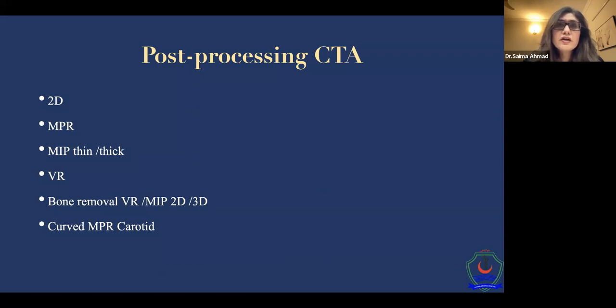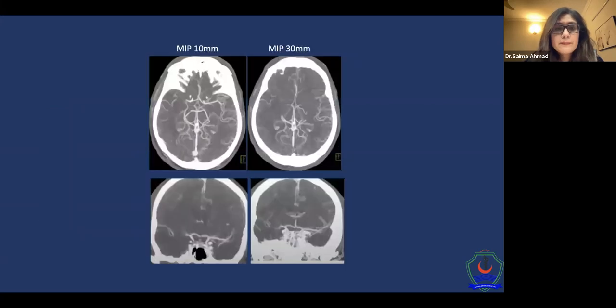Sometimes when you make the 3D reconstructions, it is very, very easy to pick up the site of the occlusion, especially the distal occlusion. But it is always time consuming. So whatever you are doing, do it fast.